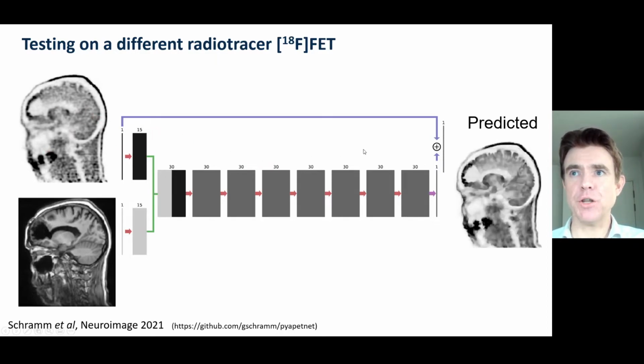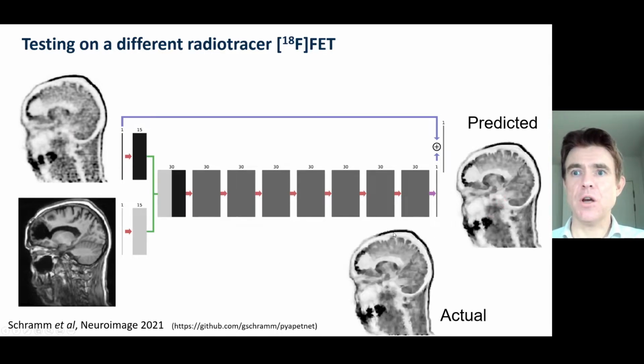And the prediction that they got was this. And when they compared it to the actual MapEM MR guided reconstruction, you can see they've got a very good agreement indeed. So very impressive results for generalization of a trained convolutional neural network.